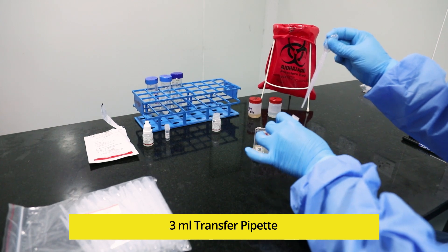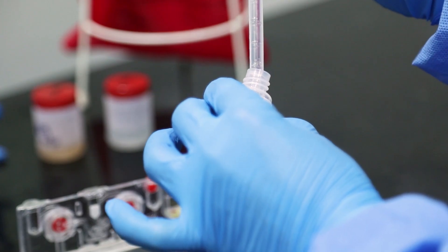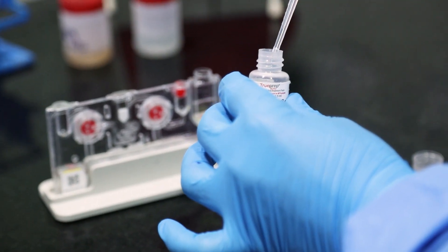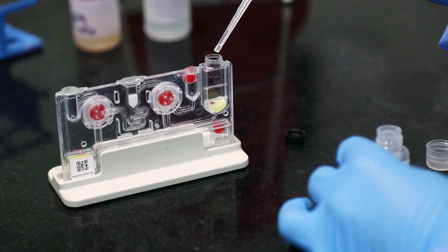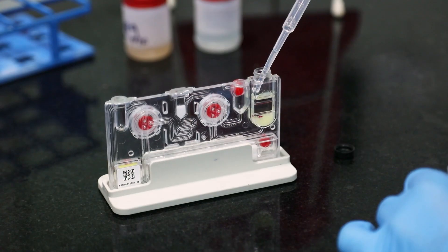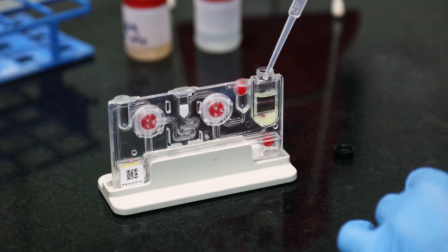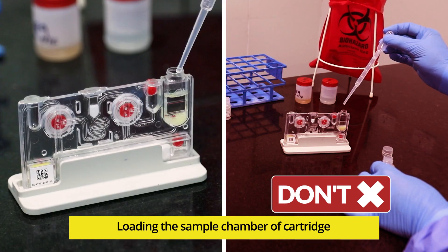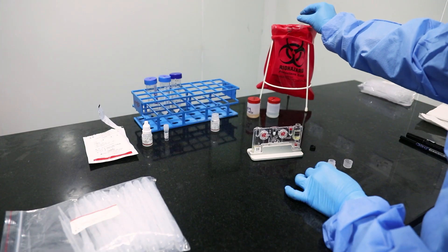Press the bulb of the transfer pipette. Immerse the pipette into the Lysis buffer bottle and release the bulb slowly to aspirate completely. Immerse the pipette inside the sample chamber of the cartridge and transfer contents slowly. Do not drop the contents of the pipette from a height. Discard the transfer pipette.